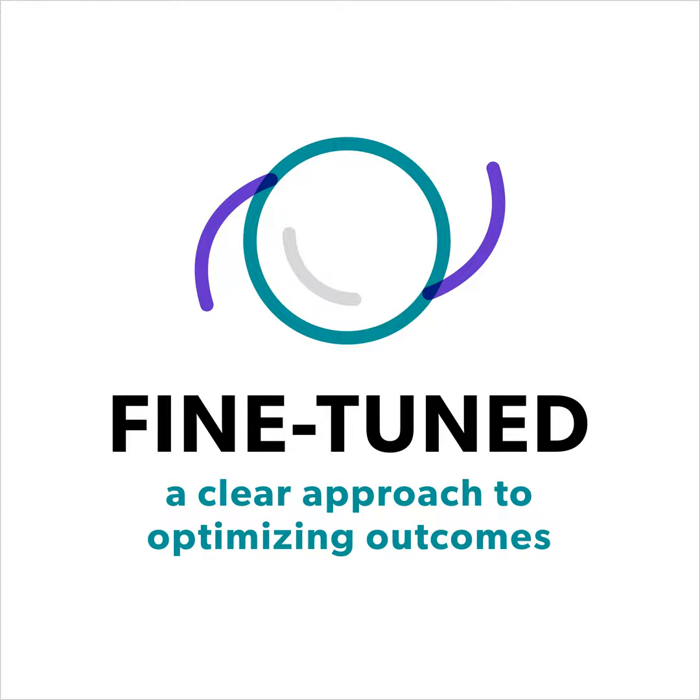Wavefront-guided LASIK affords a very rapid return of high-quality, uncorrected distance visual acuity compared to SMILE surgery, which can take several days to weeks. We also found significantly better best corrected 5 and 25% low contrast visual acuity with wavefront-guided LASIK compared with SMILE surgery.